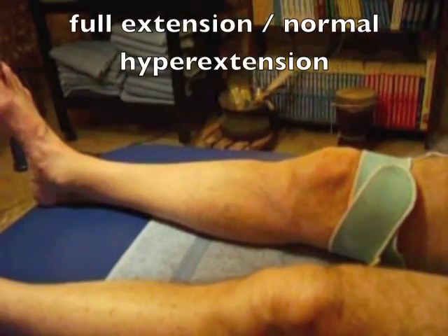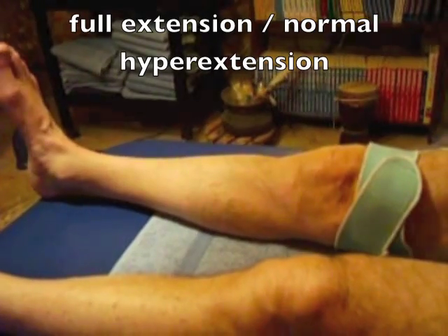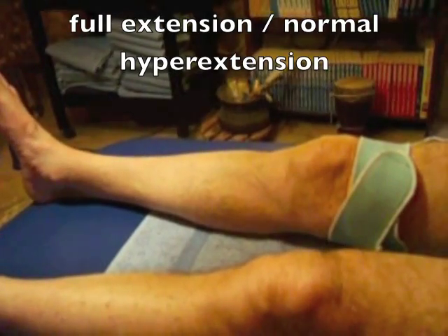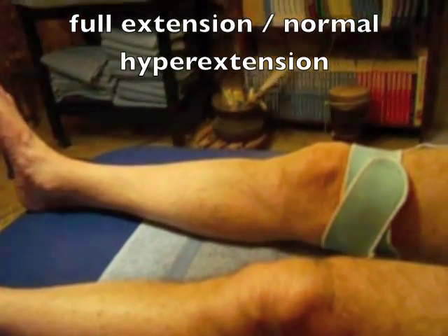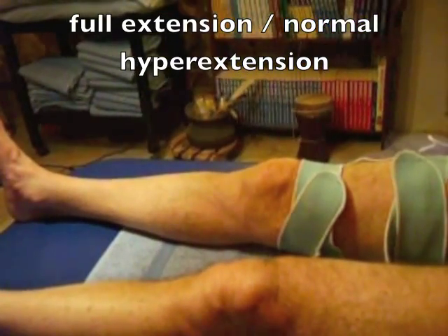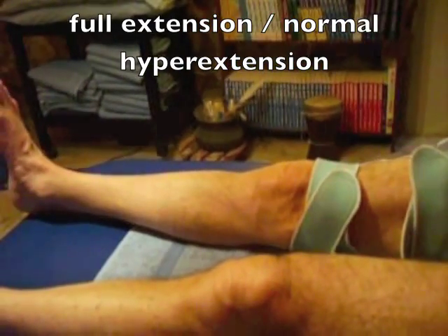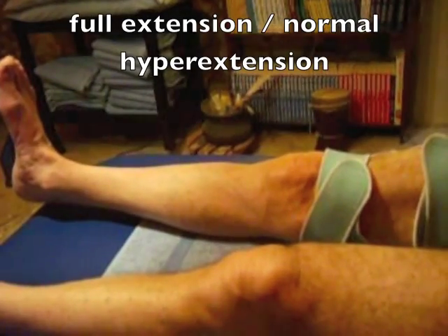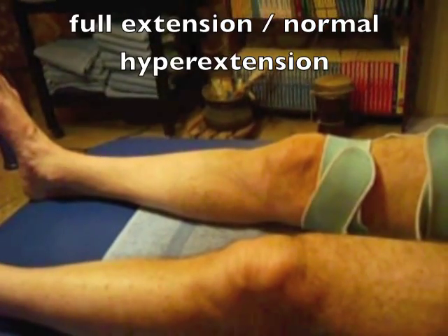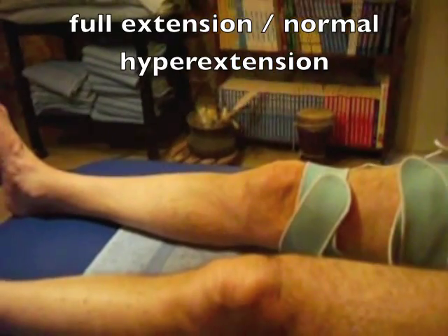The second work phase is to straighten the knee as hard as it can go, following the current. In the normal knee the heel will lift slightly off the floor or support. This is called hyperextension. The normal range of hyperextension at the knee is just a few degrees. Some people have an abnormal level of hyperextension at the knee which makes it look as though the knee can bend backwards almost. In this case the knee should not be extended to its fullest degree but only to about half way or three quarters.